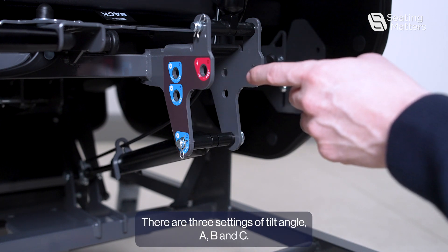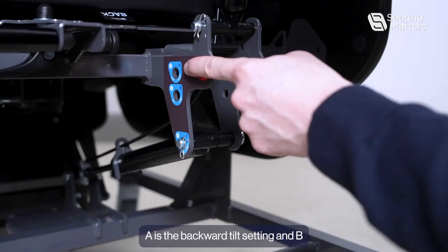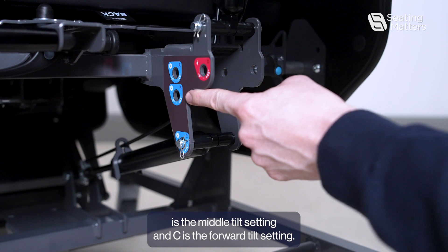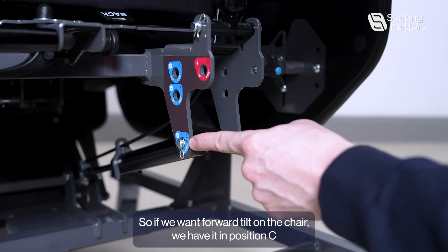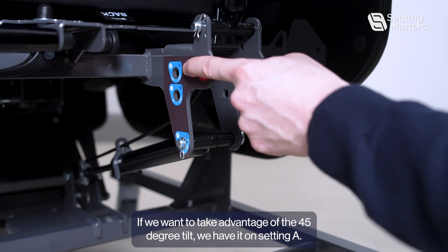There are three settings of tilt angle: A, B, and C. A is the backward tilt setting, B is the middle tilt setting, and C is the forward tilt setting. So if we want forward tilt on the chair, we have it in setting C. If we want to take advantage of the 45-degree tilt, we have it in setting A.